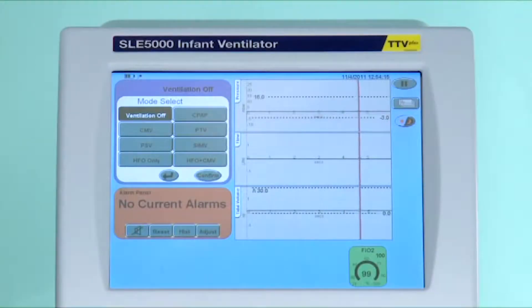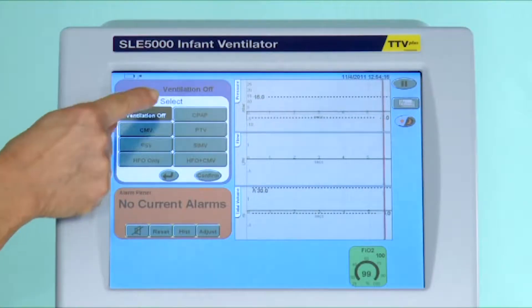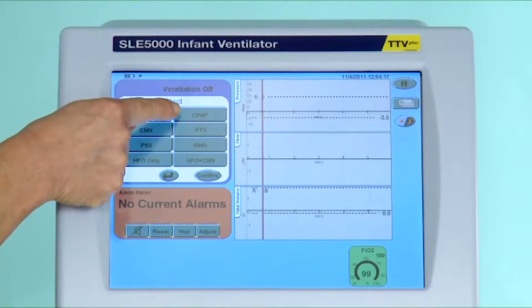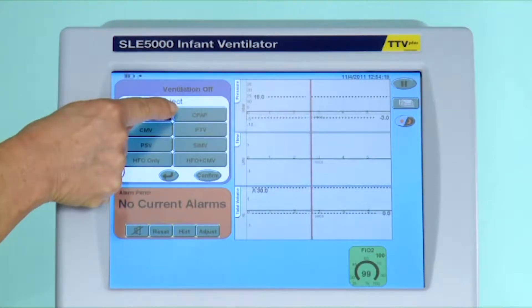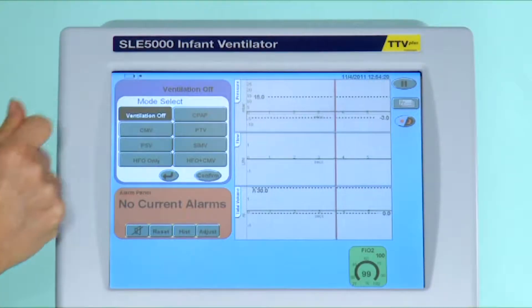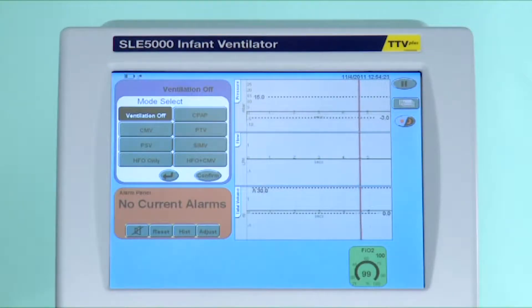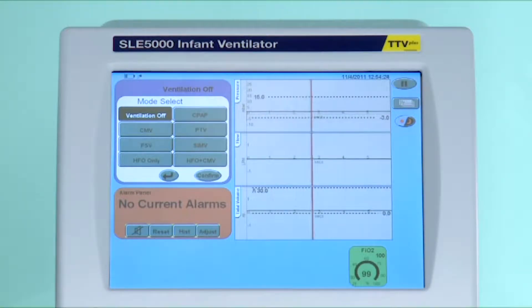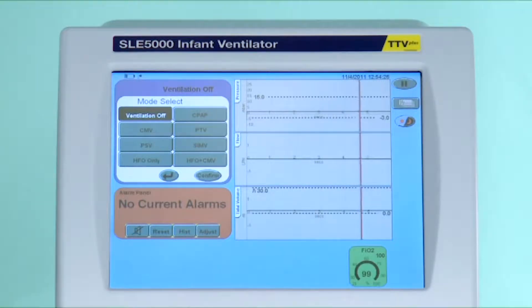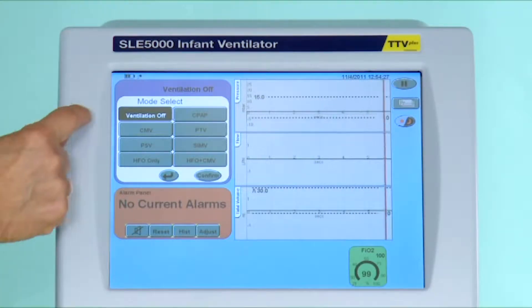The first real mode is continuous positive airway pressure, and this is done through nasal prongs. It is advisable to remove the flow sensor as you no longer have a closed circuit.